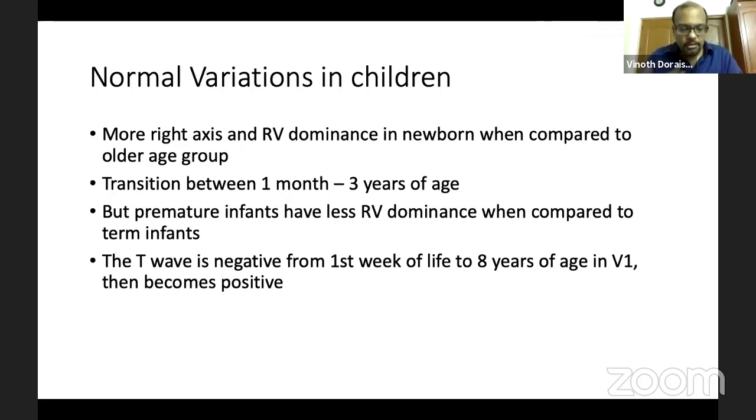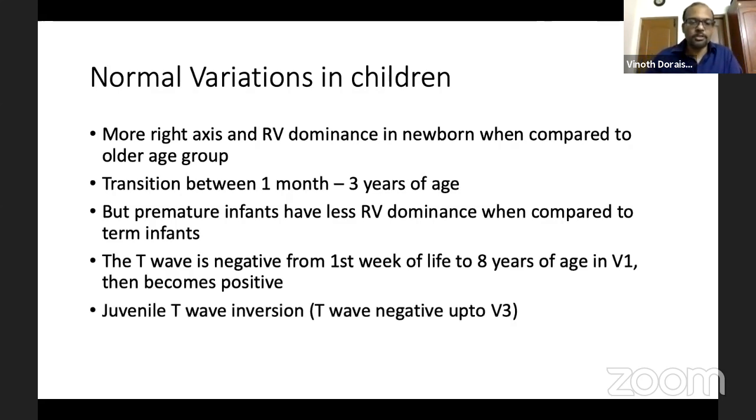And on the differences of the T wave, as I've told you, the T wave becomes negative after the first week of life in V1 up to 8 years of age, and after that it becomes positive.